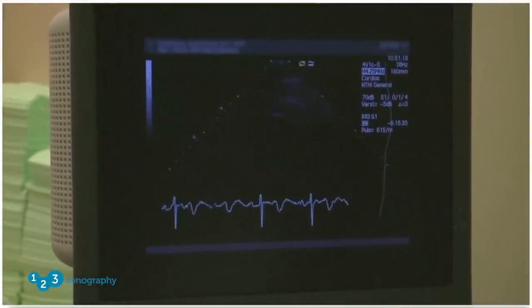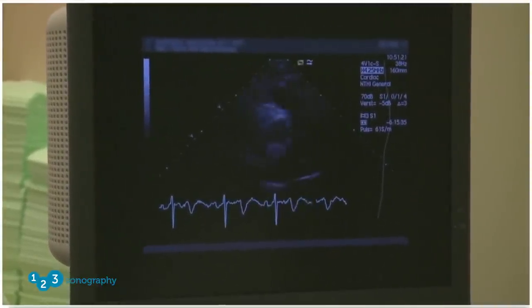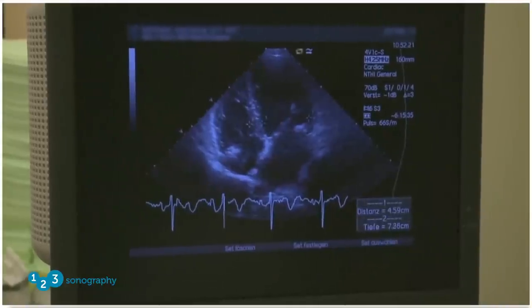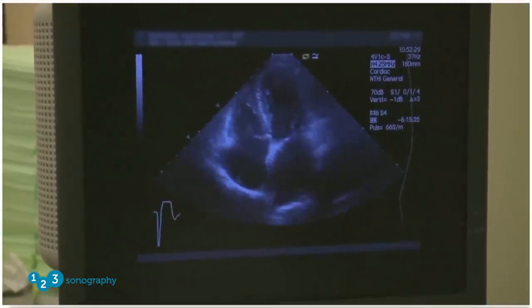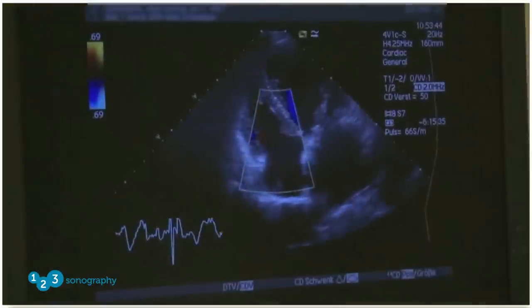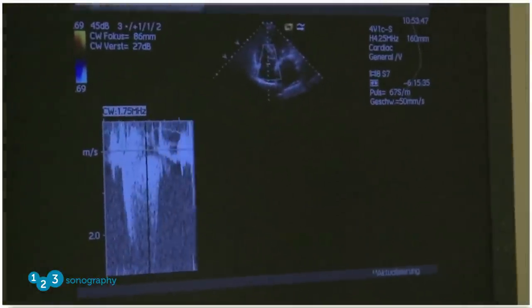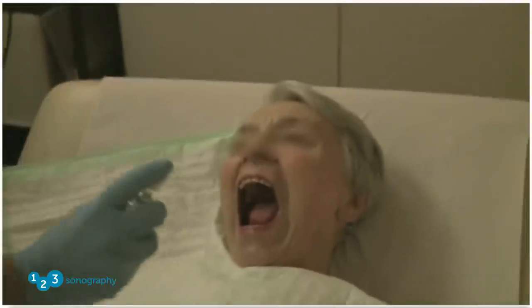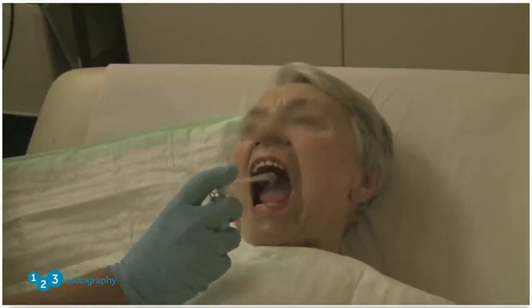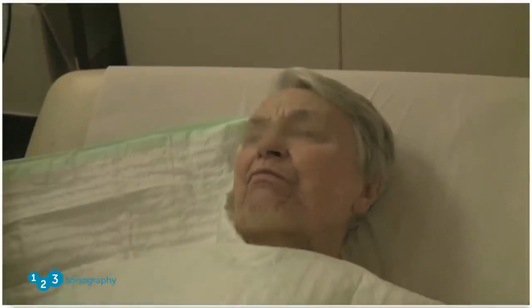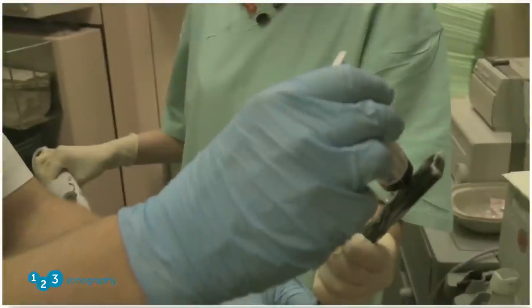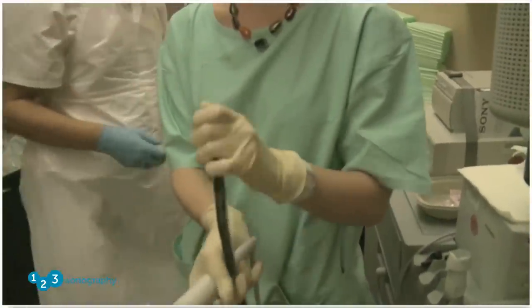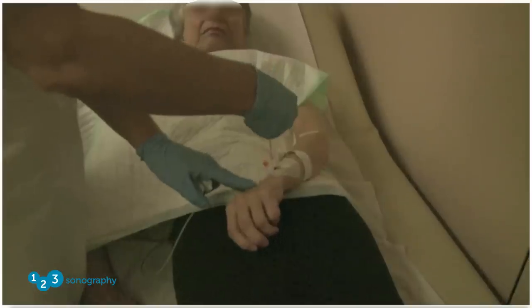We use an ECG for digital storage of images and to know what happens in each phase of the cardiac cycle. We perform measurements from the transthoracic approach so we don't have to repeat them transesophageally. Structures like the tricuspid valve we always try to evaluate transthoracically first if possible. Here you see how we anesthetize the pharynx — we give plenty of lidocaine spray and also put lidocaine gel on the probe itself, just enough so the probe glides easily into the pharynx.